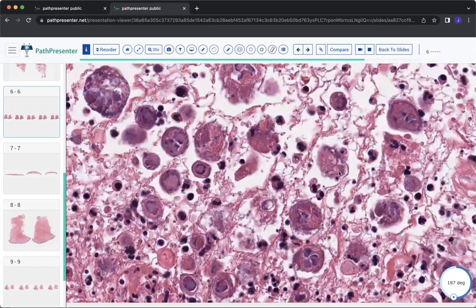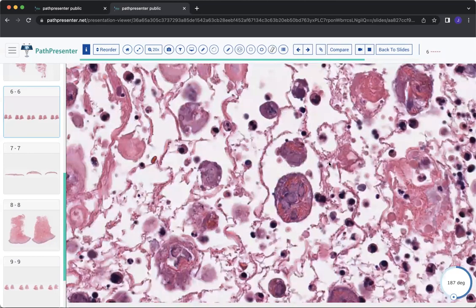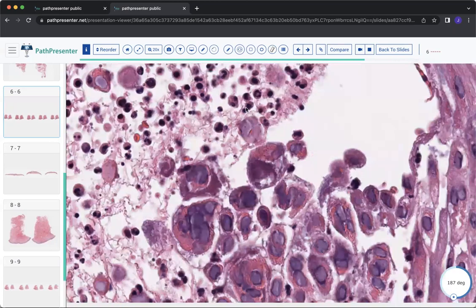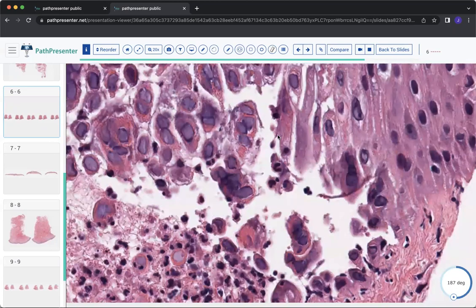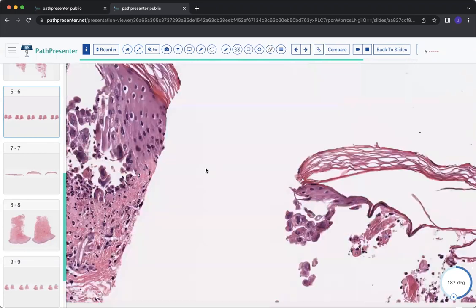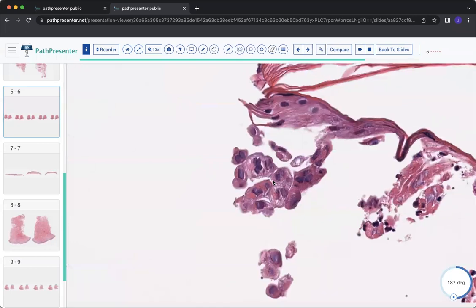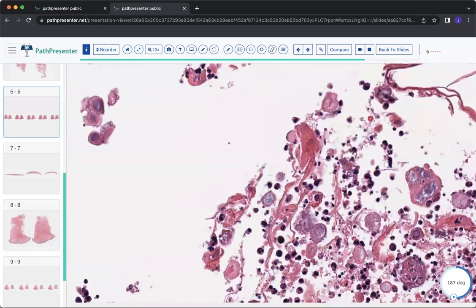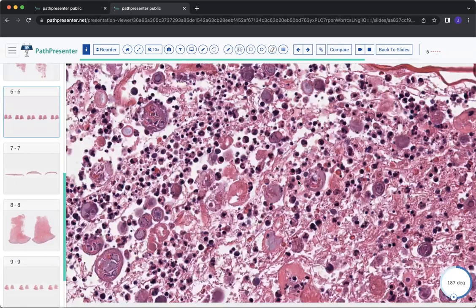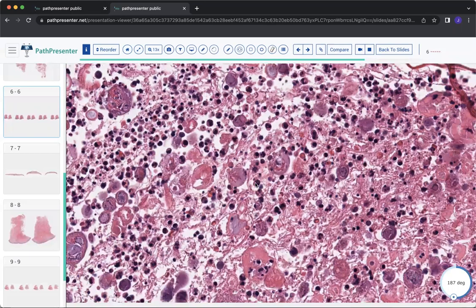It's one of the more beautiful diagnoses on H&E because it's just so striking in many cases, depending on how much viral load is here in the herpes vesicle and what evolution it is as far as the pathology goes. So be sure to look at many examples of herpes virus infection because it's definitely one that they can put on the boards just as a recognition with no clinical information whatsoever.